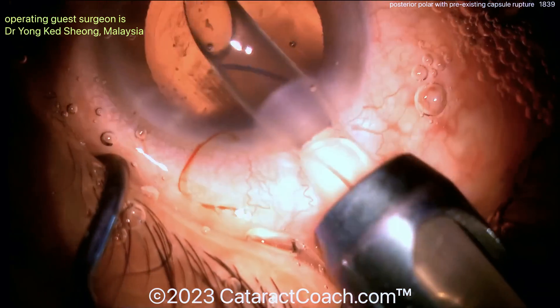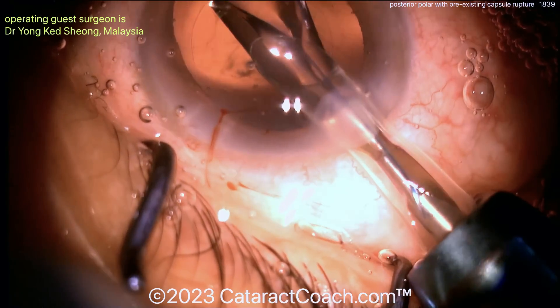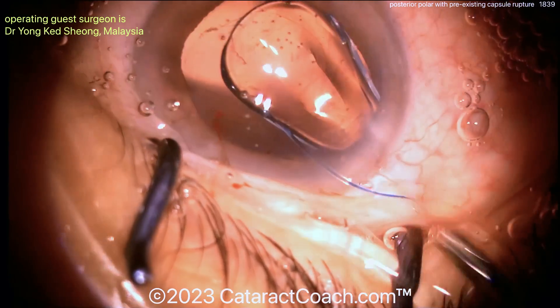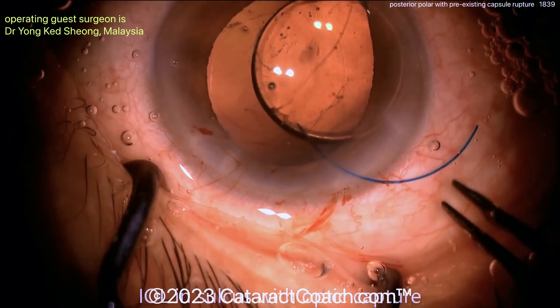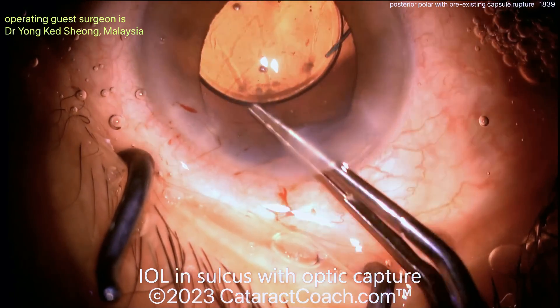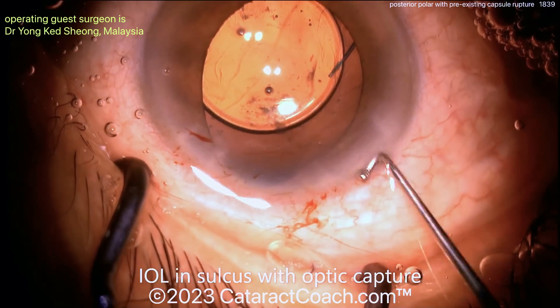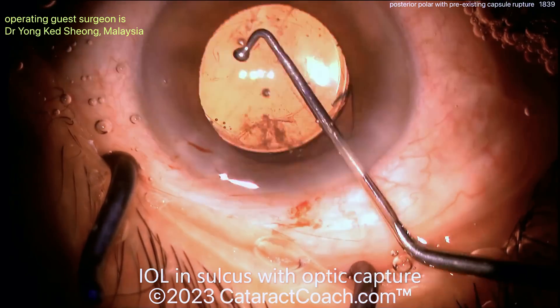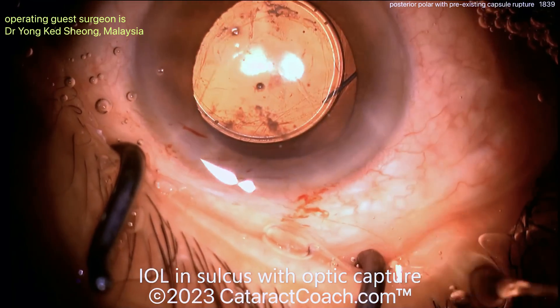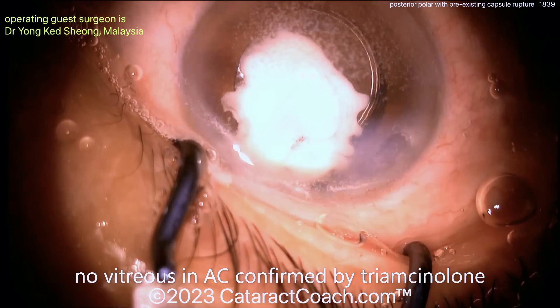More viscoelastic — don't let the AC collapse. Very good surgical technique here, you can really learn a lot from this video. At the end, good anterior hyaloid face — looks like it's intact. Three-piece lens going in the sulcus, haptics in the sulcus, beautifully positioned — that's the correct orientation. Haptics in the sulcus, optic captured like a button through a buttonhole through the capsulorhexis.